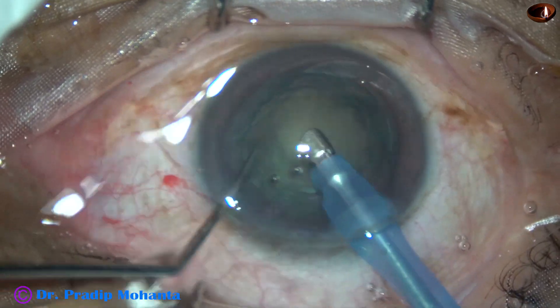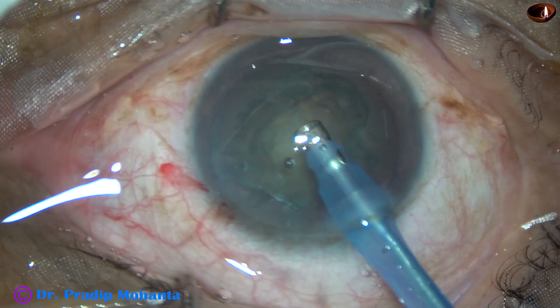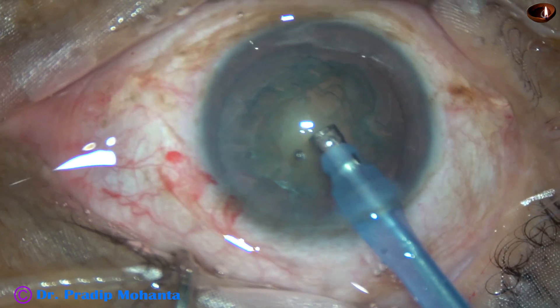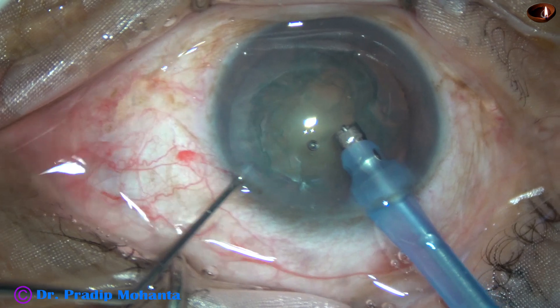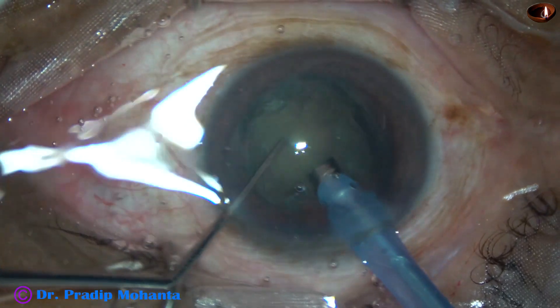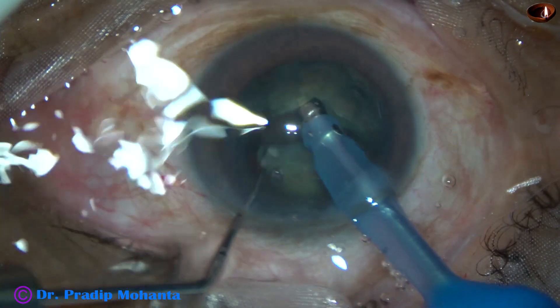First I am removing some cortex with bevel down, then turning the hand to make the bevel up. Now I bury the tip of the phaco needle just in front of the main incision into the substance of the nucleus. Hold it very firmly and chop.